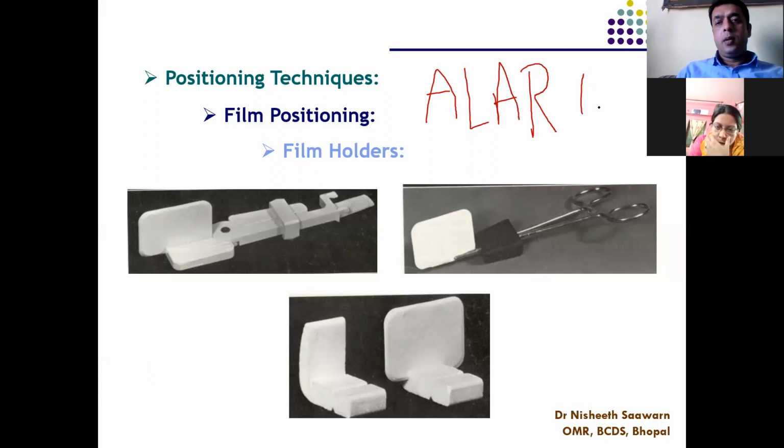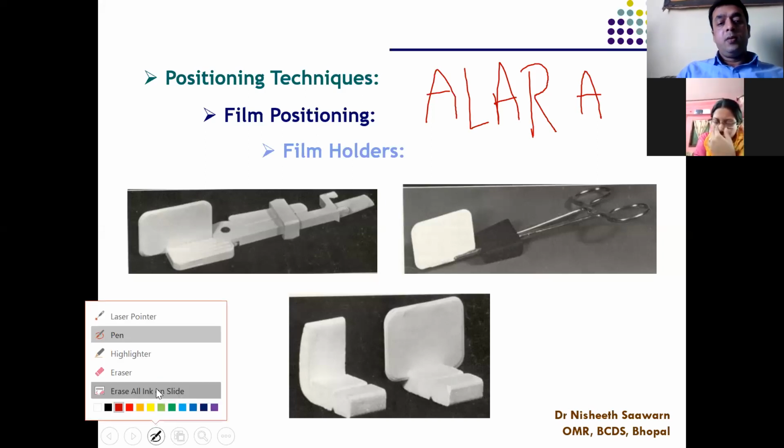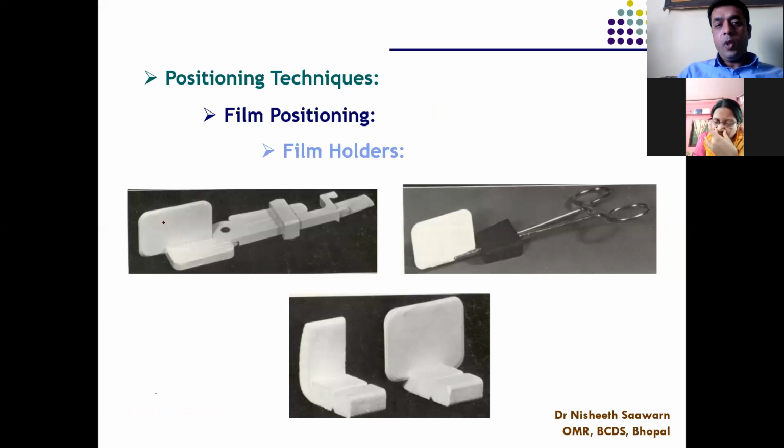ALARA principle says as low as reasonably achievable. मतलब जितना कम हम एक्सपोजर दे सकते हैं हमें पेशेंट्स को देना चाहिए. That is why we should not use fingers. We should use the film holders.